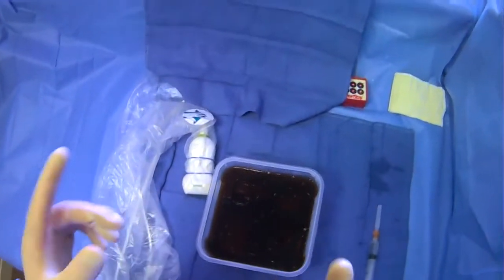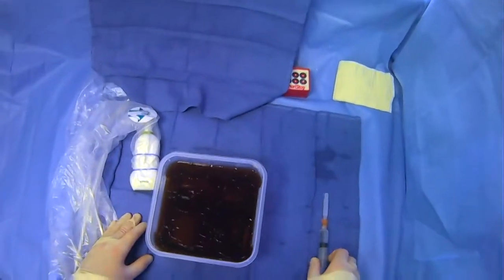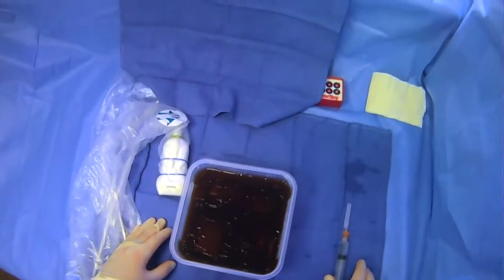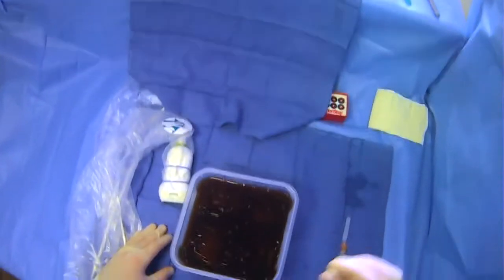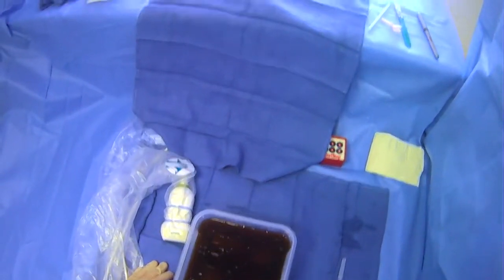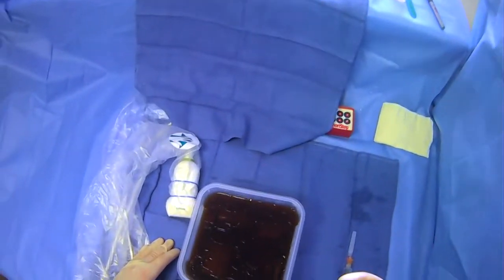There are a number of ways that you can do this. For this video, we're not going to be using ultrasound. We're going to be using lidocaine with a 25-gauge lidocaine needle, and we already know where we're going to go. We know the depth, so we're basically going to be giving lidocaine and aspirating periodically to see if we are in the right space.